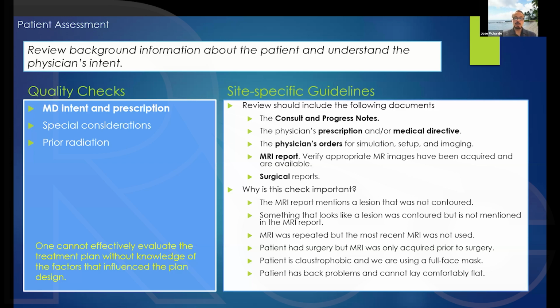It's possible that the patient is claustrophobic and we're planning on using, or we are using, a full face mask, right? It's also possible that the patient has back problems and cannot lay flat. So all of these things are going to affect how we design the treatment plan and how we make the treatment plan optimal for the patient.